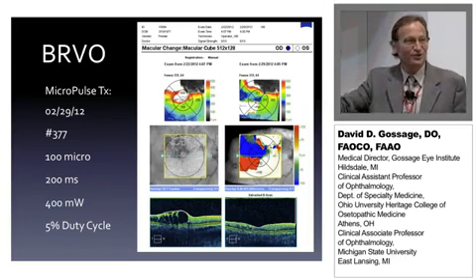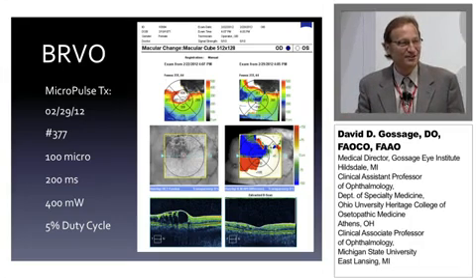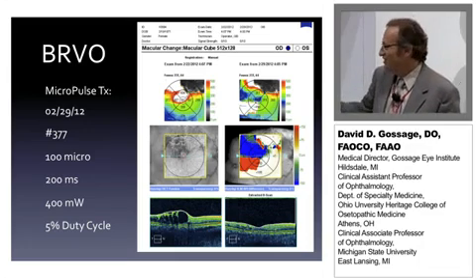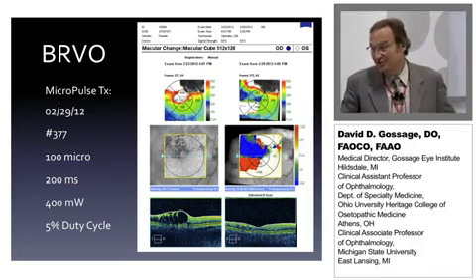I usually tell the patients, come back in a few months and we'll take a look at you. But she came in for some other reason, said, hey doc, my vision's so much better. I'm like, yeah, right. So I said, well, come on back, let's just do an OCT and take a look. And sure enough, it was so much better. And to me, that's just an amazing, amazing case. That in 6 days, you could see that effect.